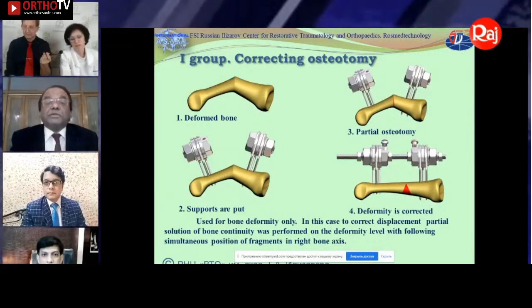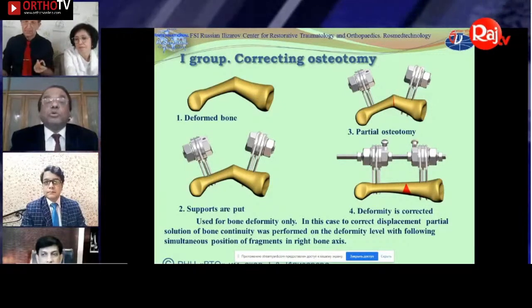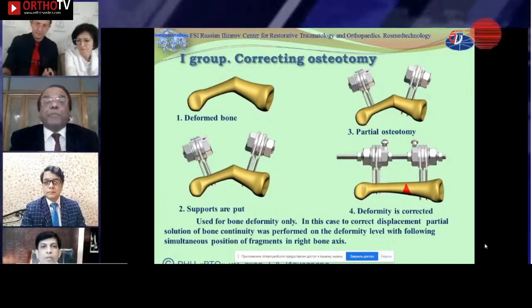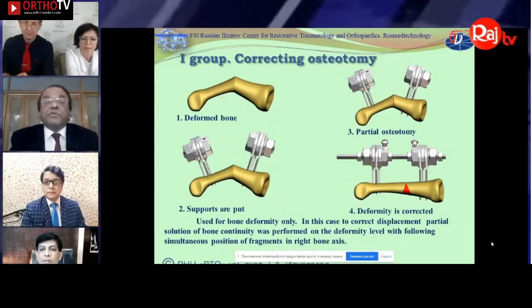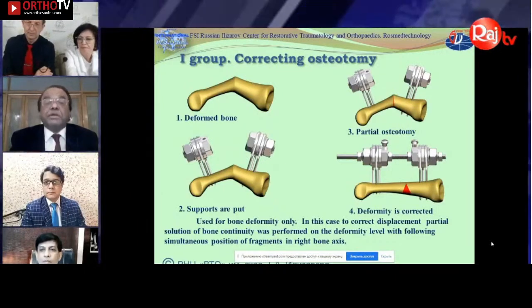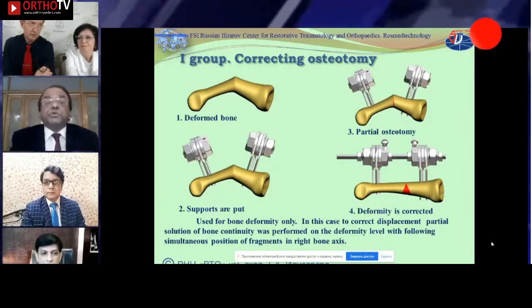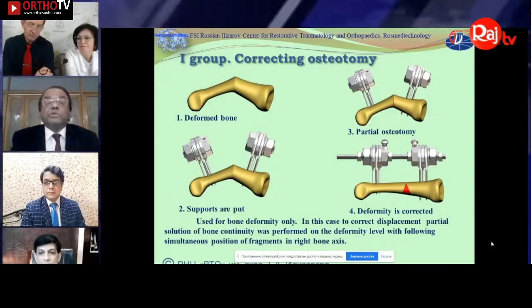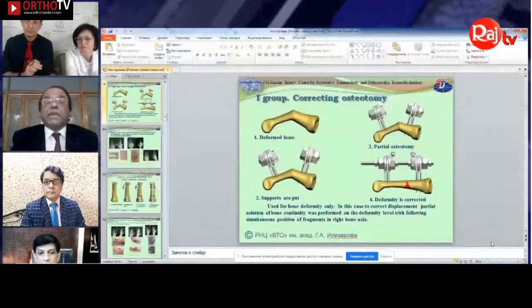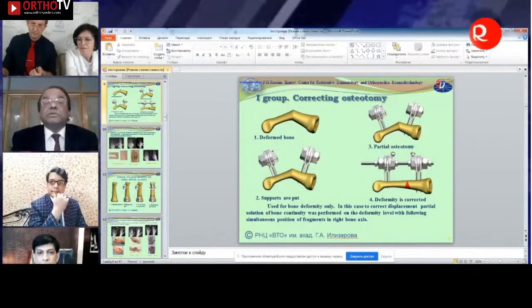Dorsal hand, only dorsal. You can see from this side, not from this side. Volar aspect, no. You just put the wires, then you bend and fix it with these nuts and bolts. And this is your angulation, you can put the hinge here. Without hinge you can do straight, you don't need a hinge. Then see, this is a Y-shaped regenerated bone. Accurately corrected, even 90 degrees you can correct.